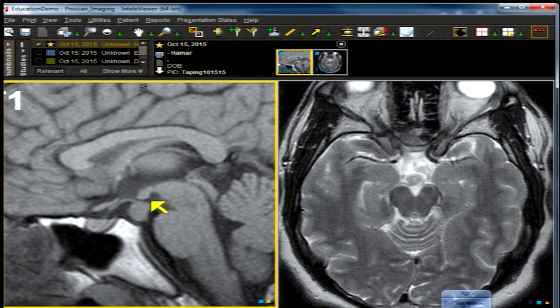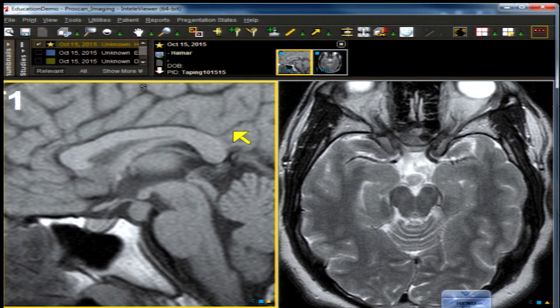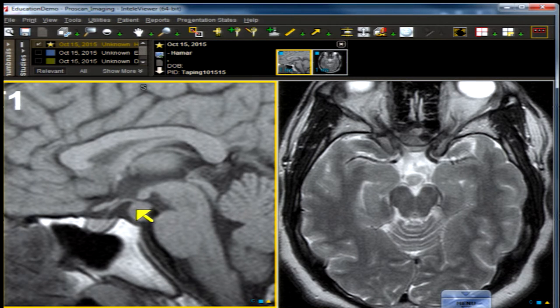These lesions involve the tuber cinereum, which is part of the hypothalamic-pituitary axis. They are also part of the limbic system, which includes the mammillary body, the mammothalamic tract, and structures coursing around the corpus callosum such as the cingulum into the temporal lobe. The lesion is smooth and gray — virtually iso-intense with gray matter.